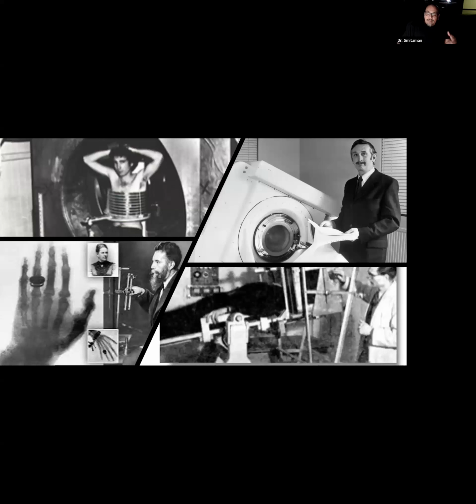Despite this, ultrasound has an important role in identifying muscle variants, distinguishing cysts and solid neoplasms, assessing vascularity, and is also really helpful for guiding superficial percutaneous interventions like aspiration and biopsy. So we like to do a lot of our muscle biopsies, when we do get those requests, under ultrasound.